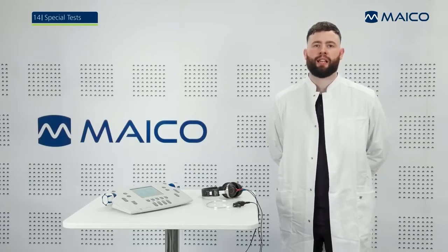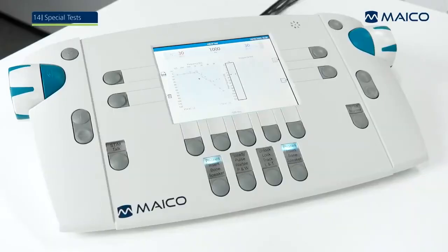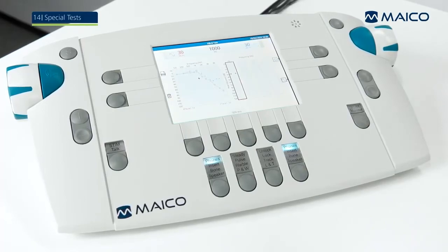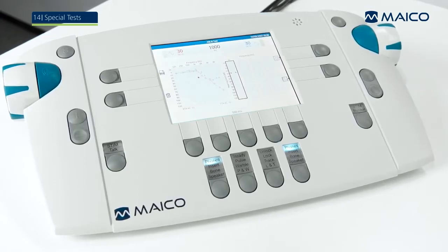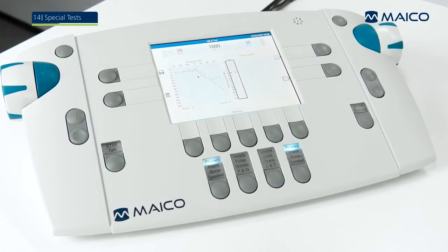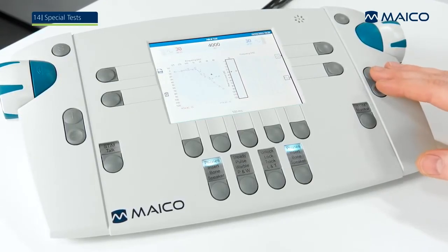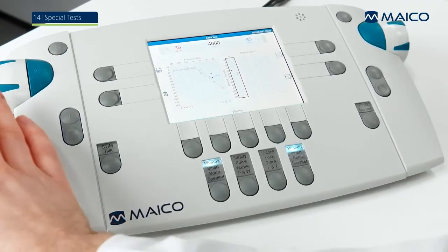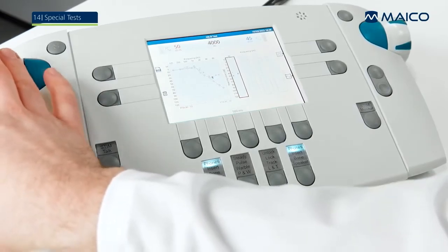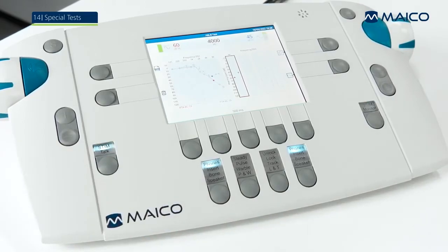The alternate binaural loudness balance, ABLB or Fowler test, is a recruitment test that directly evaluates loudness balance. The test is used when a unilateral hearing impairment with an interaural hearing threshold difference of at least 30 dB is present. Select the frequency and the corresponding over-threshold levels. Use the stim button to start the ear side alternating presentation of the pure tone.